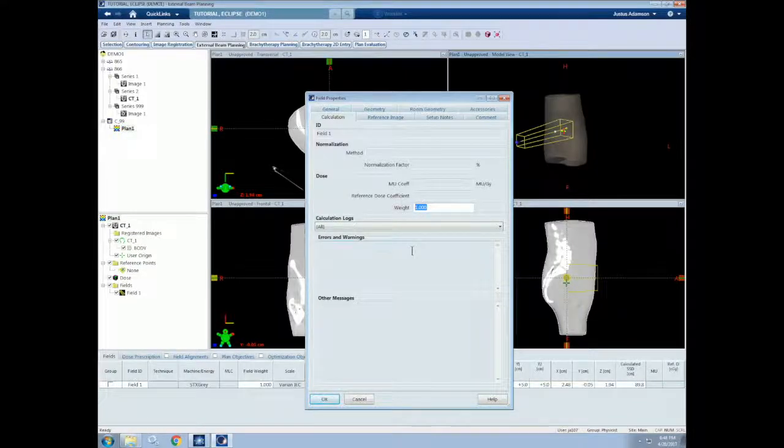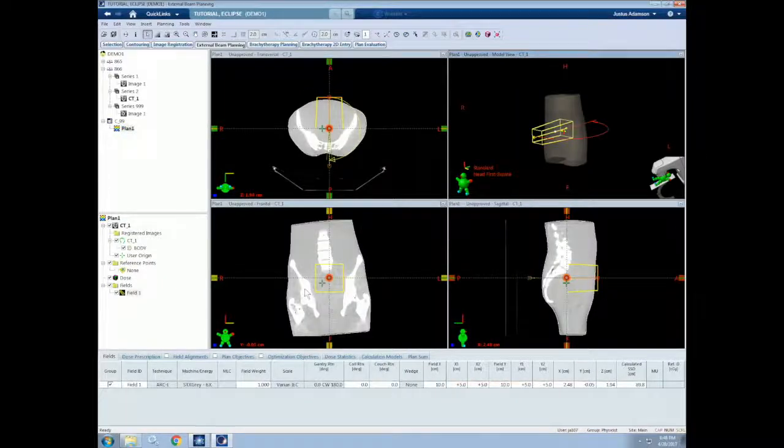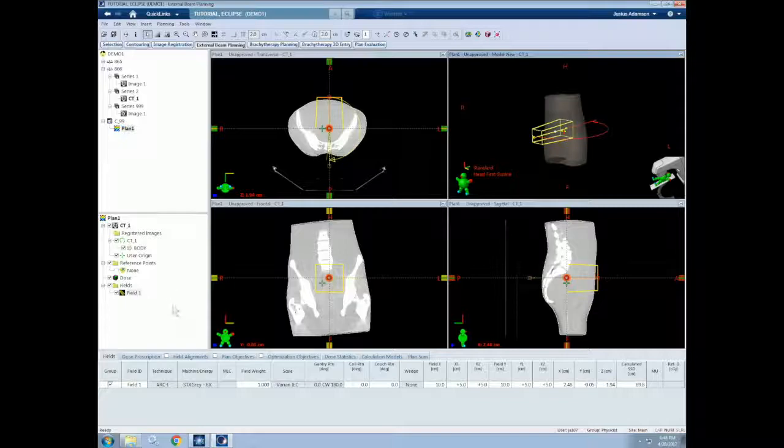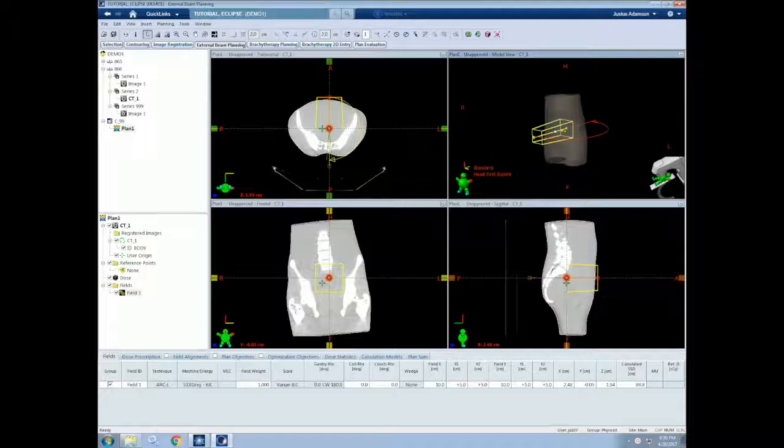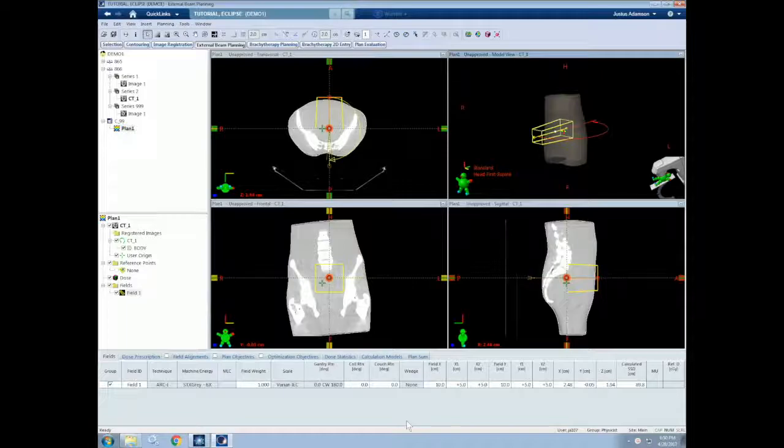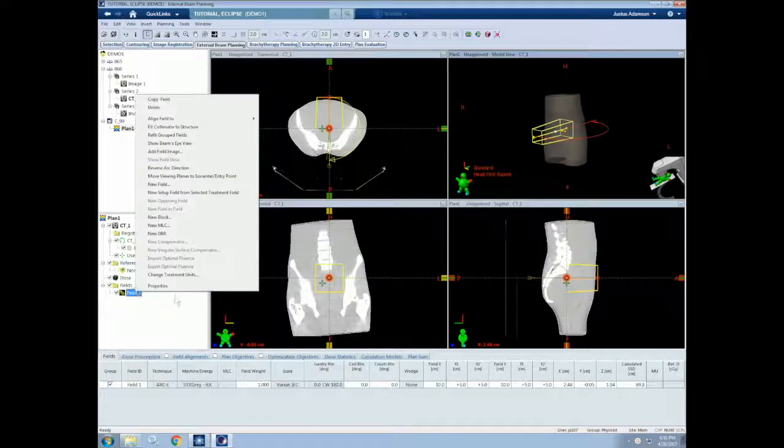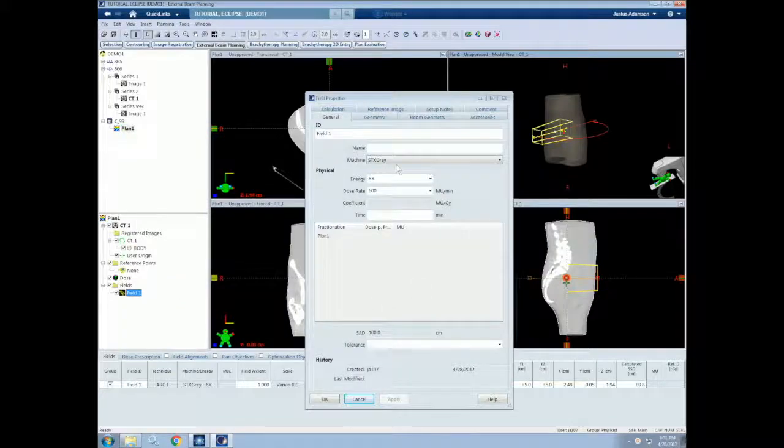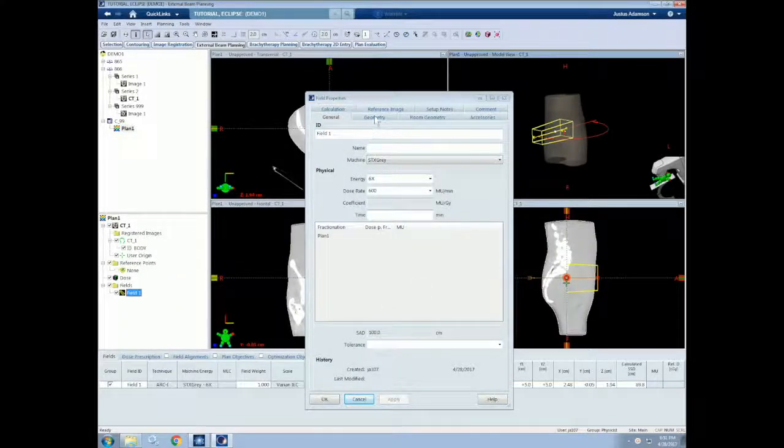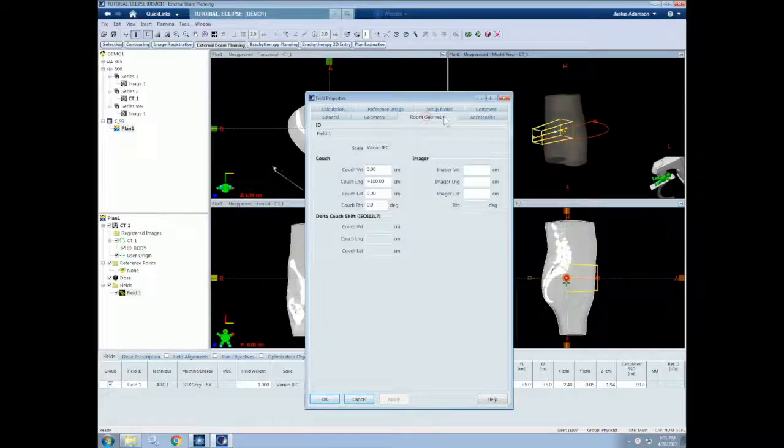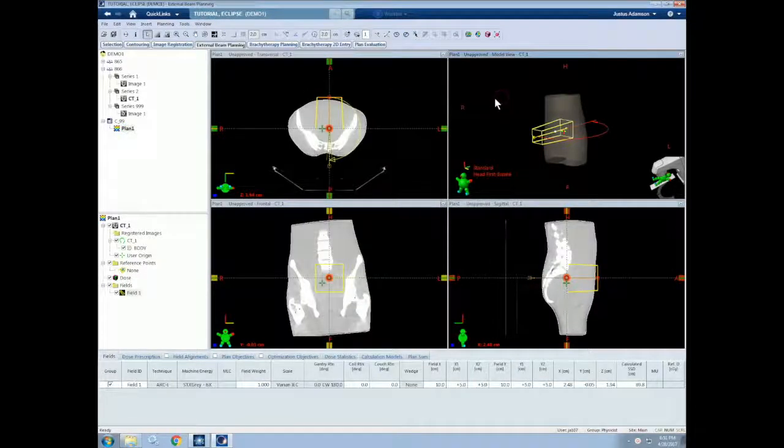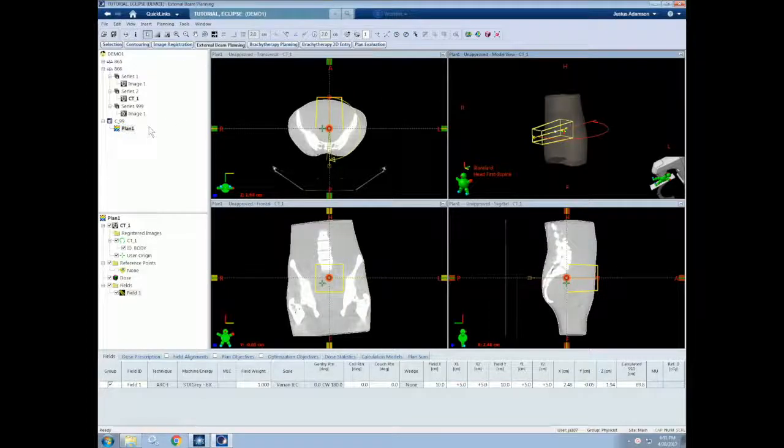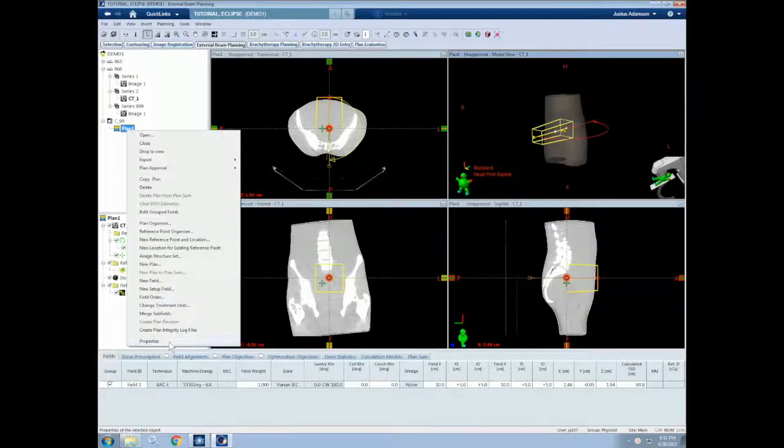Once we finish our inputs, we can click OK and our beam will be created and show up on the left under our field section here. As I mentioned earlier, many of the beam parameters for each added field can be edited down at the bottom over here. But we can also pull up the field parameters window by right clicking on field and selecting properties. So this is the same window that we had before, and all the things that we entered can be changed. We can also right click and select properties for the plan, the course, and many other things to change the parameters that we have already input.